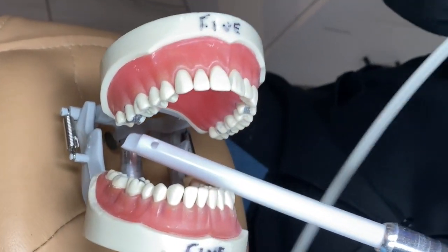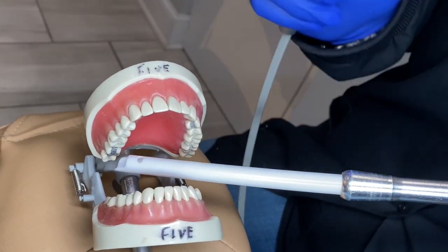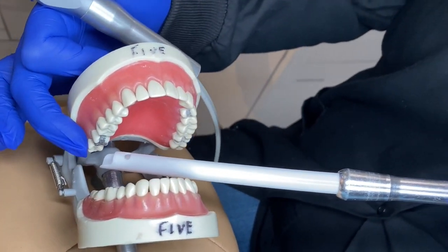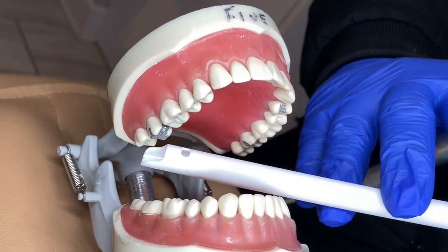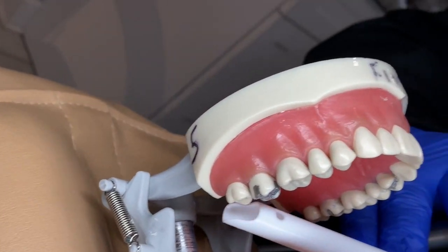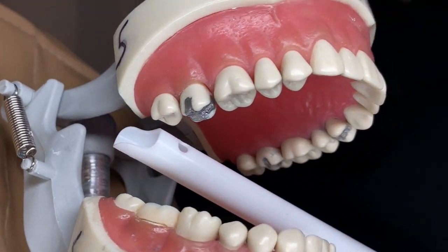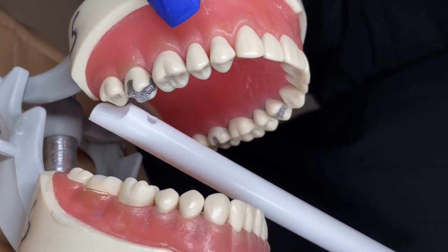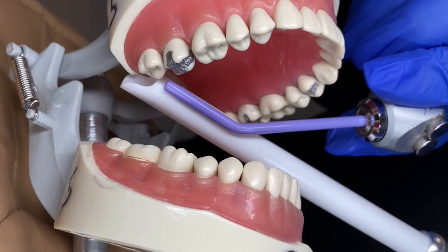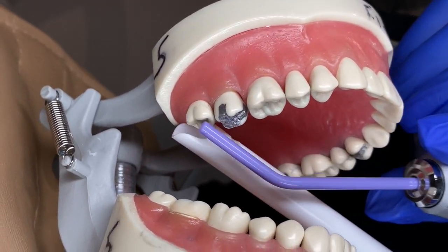Also always have something in both hands — your air water syringe. If your doctor is on the buccal of the upper right, you're going to be on the lingual, kind of occlusal. The water will run towards the back, so you want to catch it. If they're on teeth one, two, or three, you could be on the lingual occlusal.